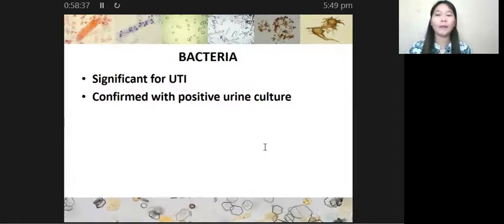That's why, di ba, bago mag-collect yung pasyente, sinasabi natin, ma'am, punasan or mag-wash ng external genitalia. Kasi ang urine normally dapat sterile yan, unless nagkaroon ng contamination from the different areas na merong normal flora or merong UTI yung pasyente natin.